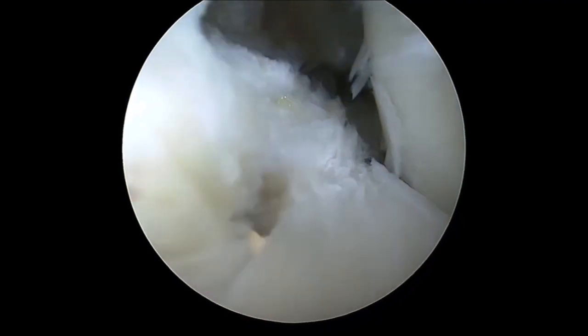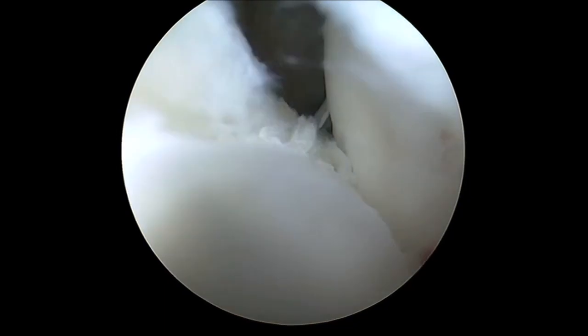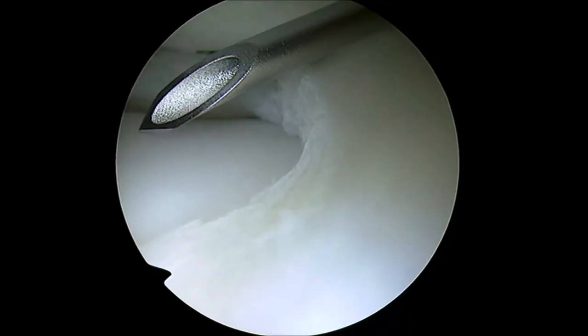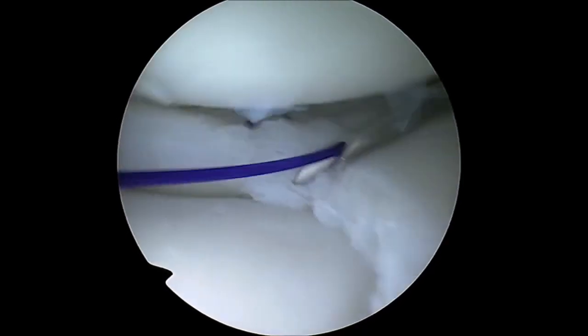This technique allows a direct view of the lesion, providing a clearer understanding of the tear pattern, anatomic reduction, and its safe repair. As in the case presented, the lesion extended to the body of the meniscus, so an additional repair using an outside-in technique was added.